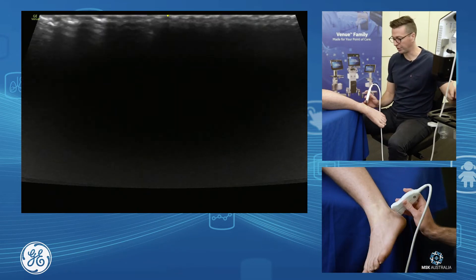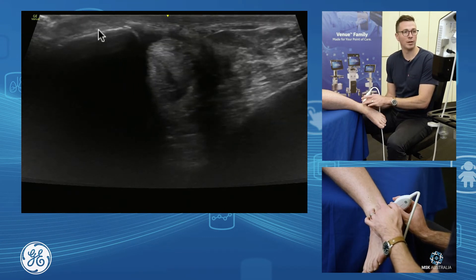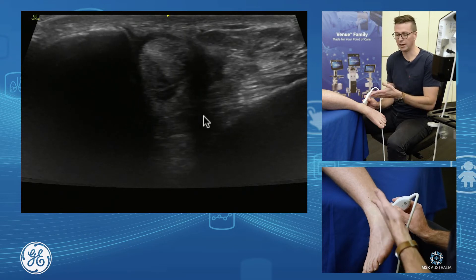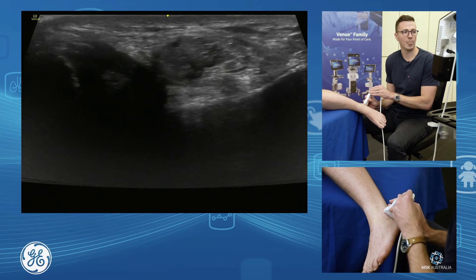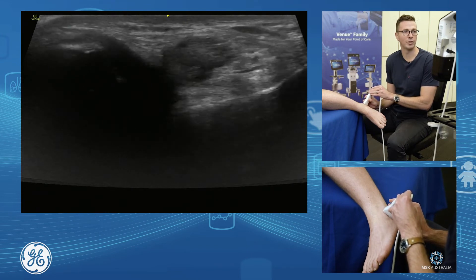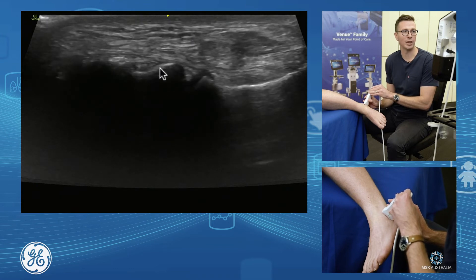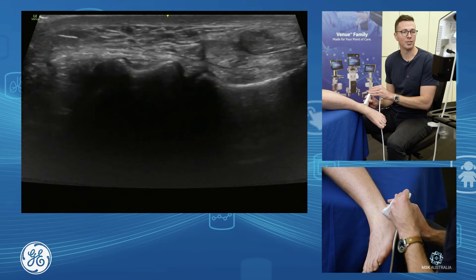The other joint we want to assess is the subtalar joint. Grab your fibula, have a look at your peroneals, come down — we have our fibula and our calcaneus. Now bring the probe just towards the distal foot, following the calcaneus. We see our talus come into play, and here is our subtalar joint — this is the anterior lateral aspect of our subtalar joint.